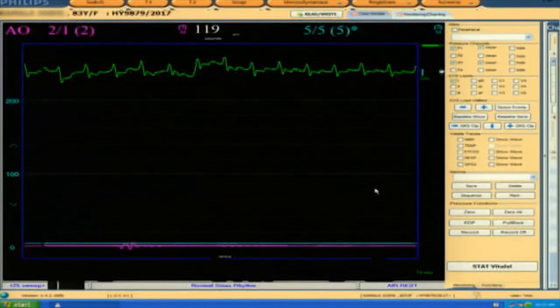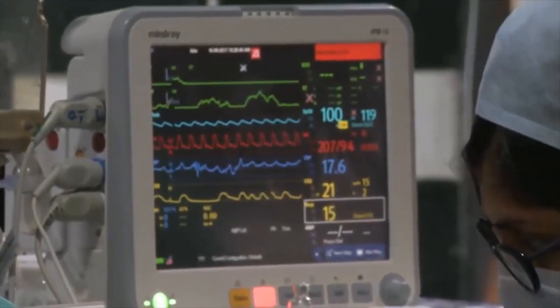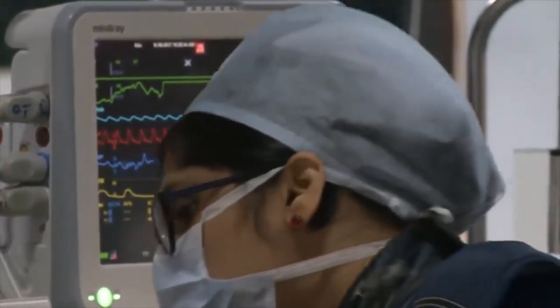Okay. That's fine. We'll do an aortogram here. Our pressure is 180/75, fluoro. We lost the wire. Actually, the wire won't come out from this. Oh, that's a problem. So what we'll do is, show us the hemodynamics.